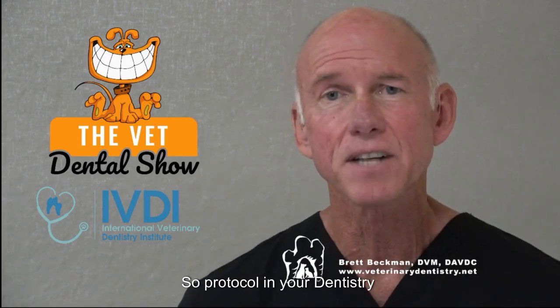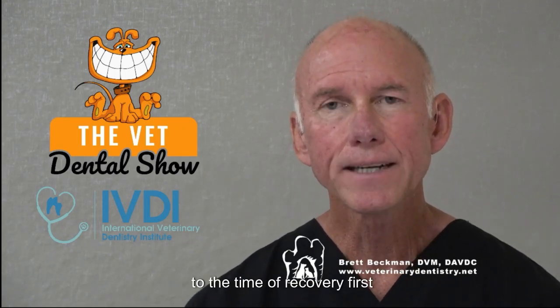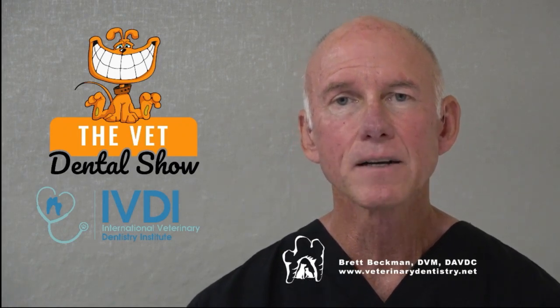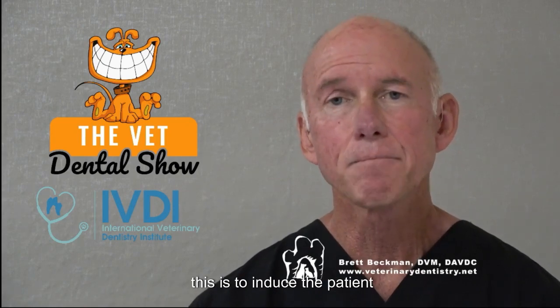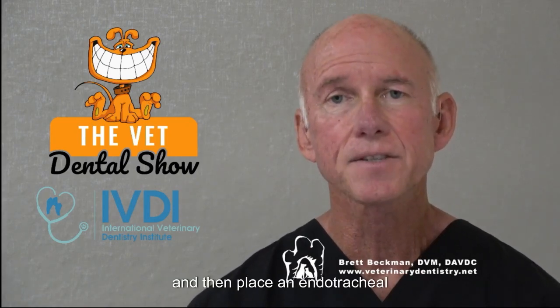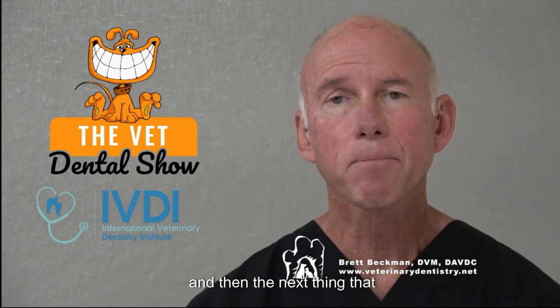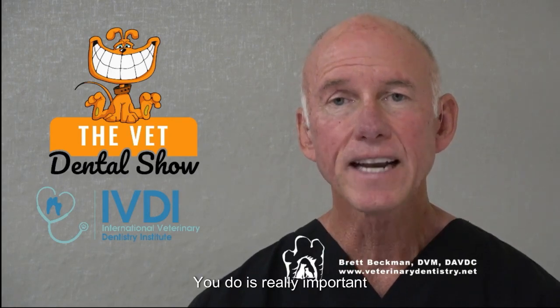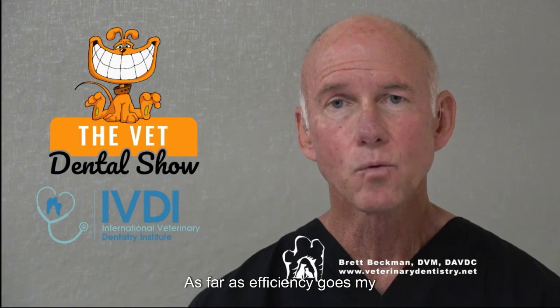So protocol in your dentistry service from the time of induction to the time of recovery. First thing that you're going to do, obviously, probably your technician's doing this, is to induce the patient and then place an endotracheal tube. Hook them up to the monitors, and then the next thing that you do is really important as far as efficiency goes.